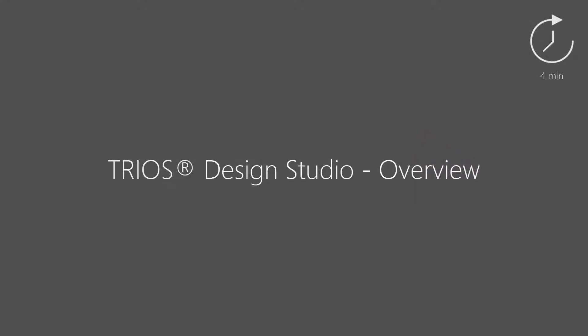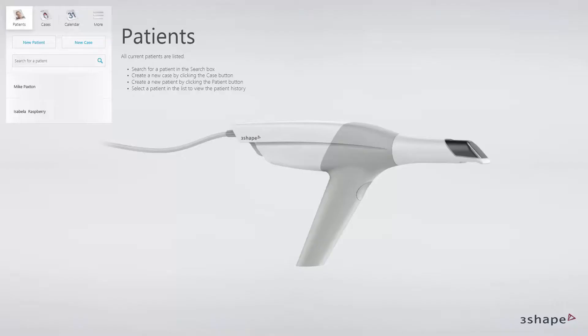In this video you will learn about TRIOS Design Studio workflow. The TRIOS Design Studio solution is a complete digital workflow with fully integrated CAD-CAM modules. This solution is dedicated to dental practices that would like to produce restorations like crowns, inlay-onlays, veneers and bridges in-house.